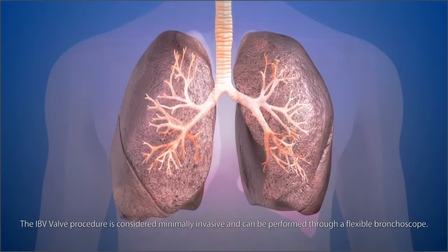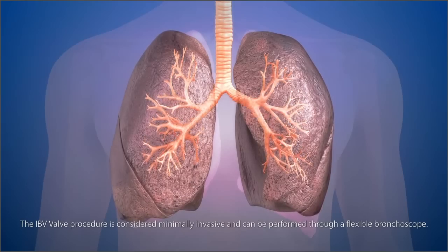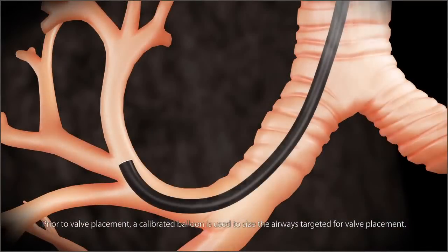The IBV valve procedure is considered minimally invasive and can be performed through a flexible bronchoscope. Prior to valve placement, a calibrated balloon is used to size the airways targeted for valve placement.